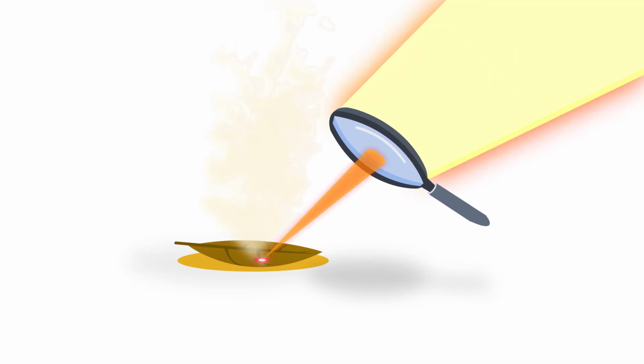This is similar to how a magnifying glass can intensify a sunbeam. The same amount of light is coming through the magnifying glass, but because it's concentrated, it is intensified and can become hot enough to light a fire. We'll explore flux gain and minification gain in more detail in a different lesson.